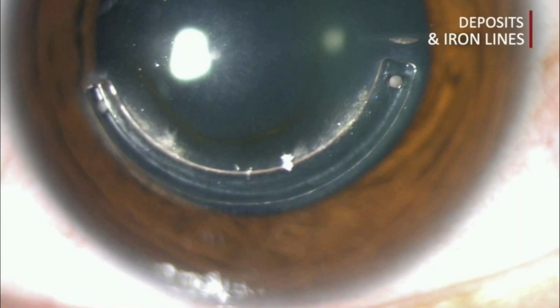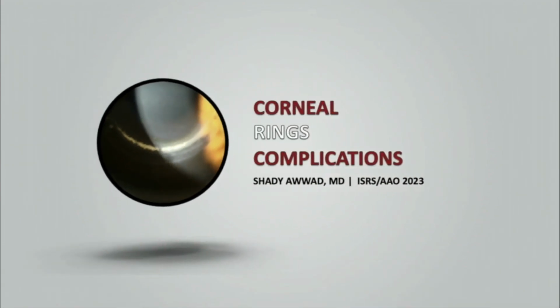And finally, this is an additional complication. It's actually deposits in the channels. They're most of the time fatty deposits and proteinaceous. Sometimes they can be ugly and they can be cosmetically a problem. So if you remove them, they usually just resolve.